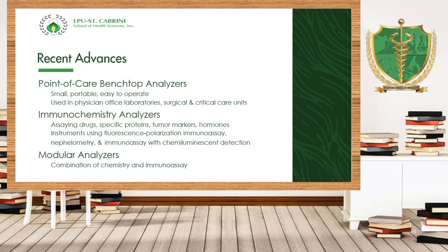However, the problem in the use of POCT, although it also requires quality control and assurance program, is that sometimes the QC is not performed, no? Kaya po we cannot justify the integrity of point of care testing. Again, take note that POCT also requires quality control. However, there are times that hindi na po nape-perform because, since it's portable and easy to use, the assumption of the patient and of the people who are using this is, why do I have to do that if this is portable?